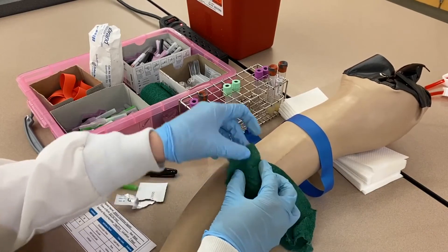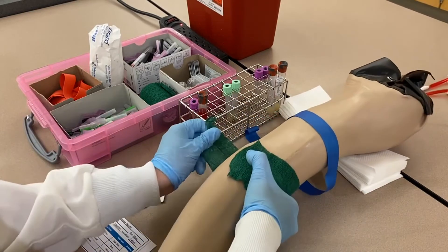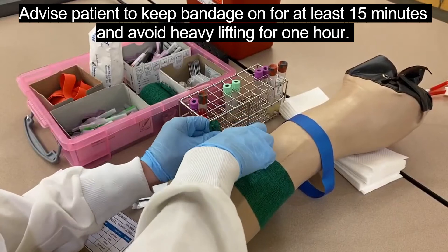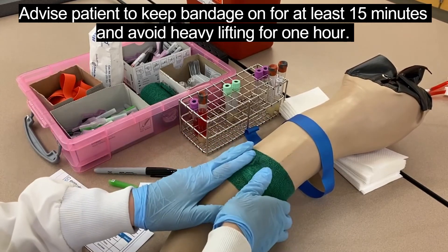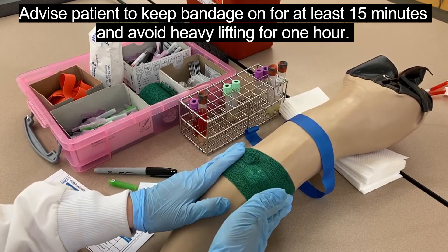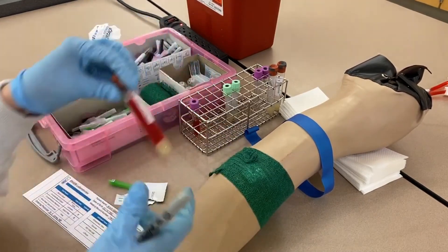Wrap the bandage around the arm. Instruct the patient to keep it bandaged for at least 15 minutes and avoid heavy lifting for an hour to avoid reopening the puncture site — especially important for patients on blood thinners. Now that he is bandaged and taken care of, I can label my tubes.